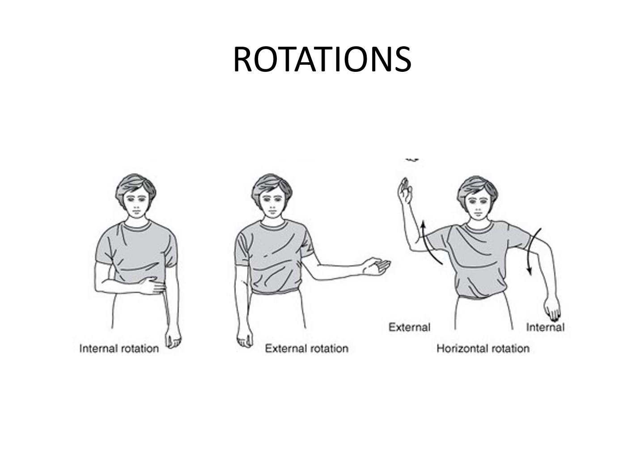Please remember, don't get confused. When you see figure 2, it is again shoulder at 0 degree, neutral position. And when you take the arm outside, away from the tummy and out away from the body, that is known as external rotation at 0 degree shoulder neutral position.